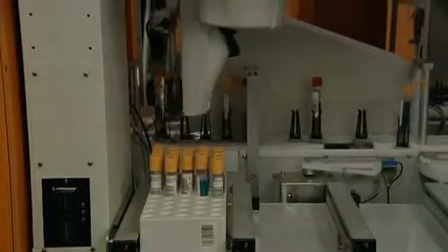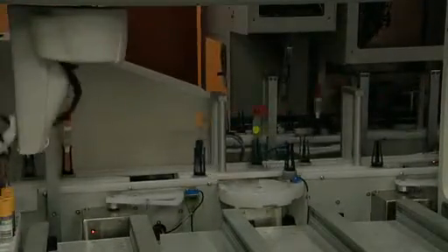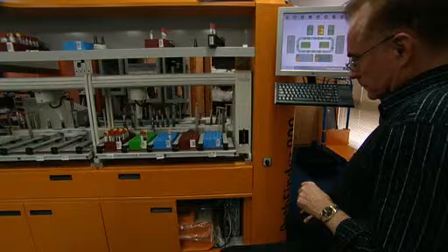So traditionally, doctors can order up to 2,000 different test types, and most commercial laboratories will probably only do the top 50, the ones that make all the money. And the ones that are requested that aren't done in that laboratory are then allocated into a secondary tube and then sent off to a specialist laboratory where those tests are done.